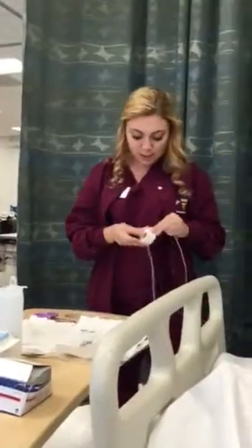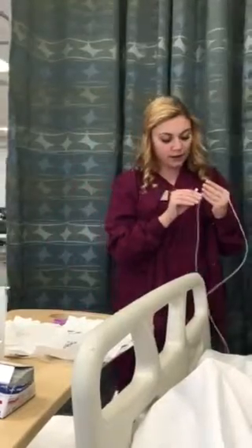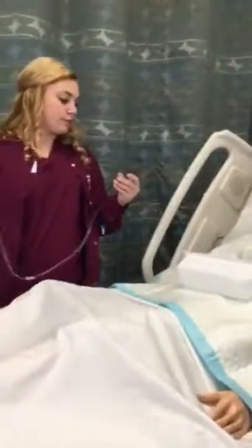So I'm going to tear a small piece of tape. Well, the tape's not coming off. I'm going to tear a small piece of tape at 55 and mark it so I know where to stop when I'm inserting the tube. Now I've asked her, I've assessed her, I've explained the procedure. Try to take all the tape so we're going to go ahead and get started.